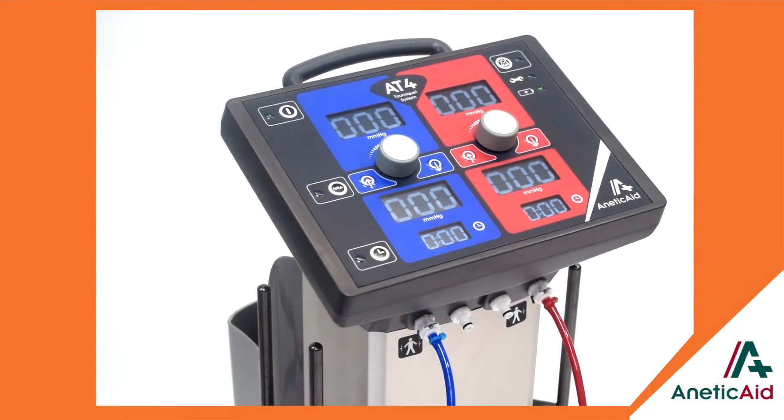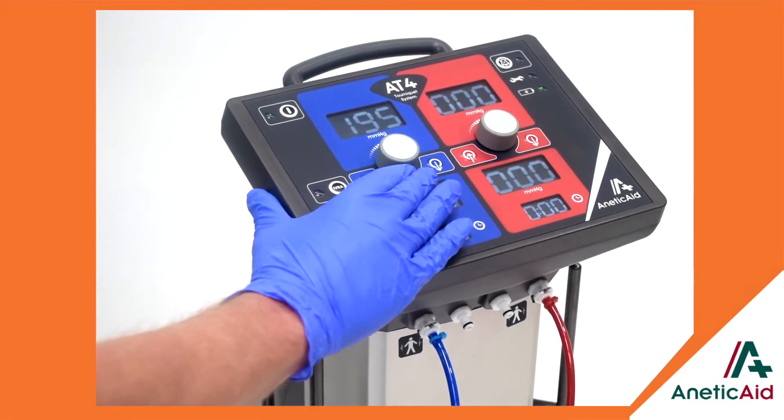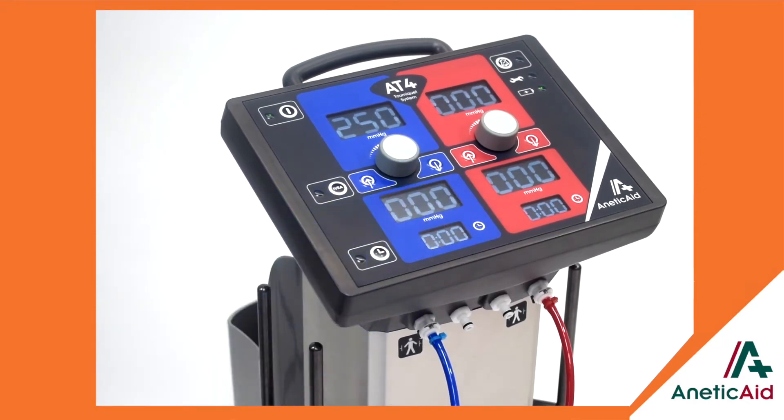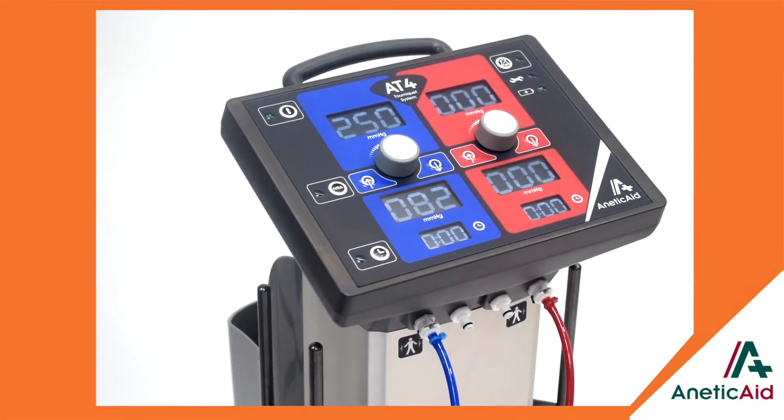Highly intuitive, the AT4 has a clear and logical fascia control panel with functional symbols, LEDs and large clear OLED displays, which combine with precision controlled dials to select pressure control and positive feel push button commands.